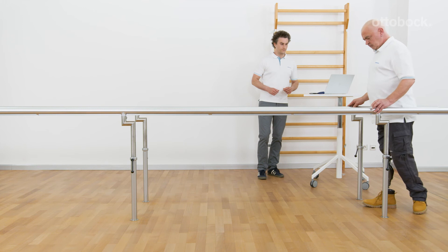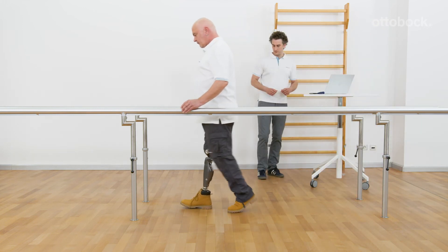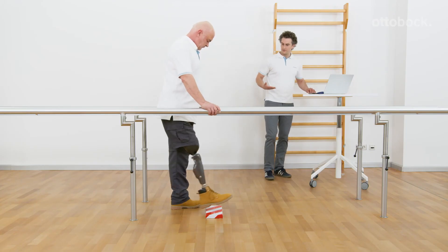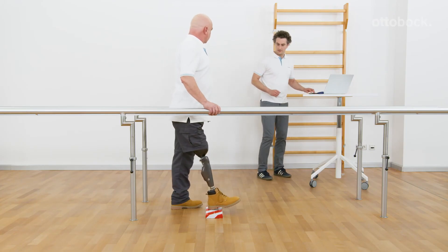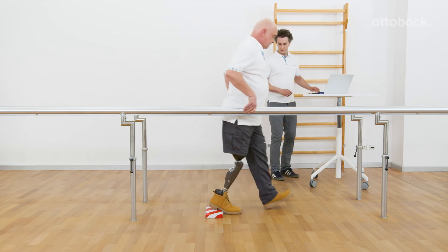During adjustments, ensure that the user always has at least one hand on a handrail. Let the user also feel what happens when they step on an obstacle and how it feels to walk down a slope in their specific safety mode setting.